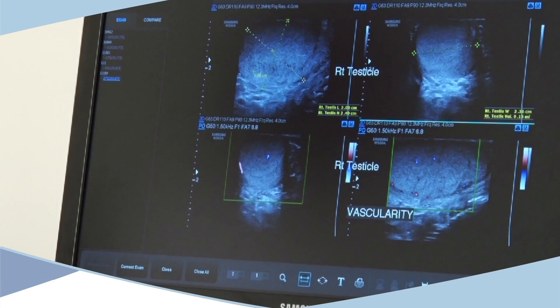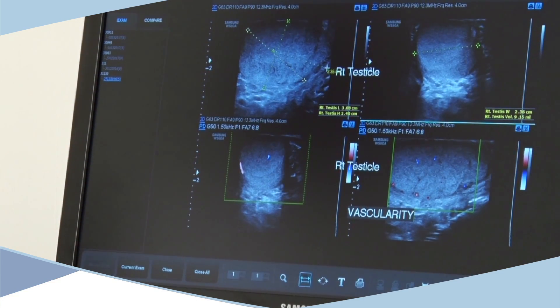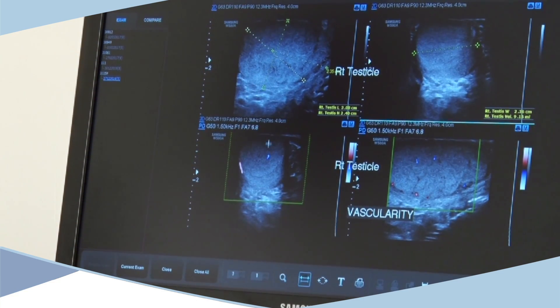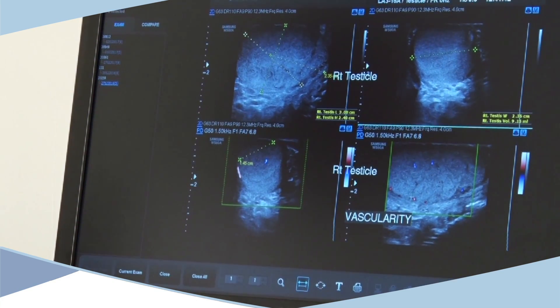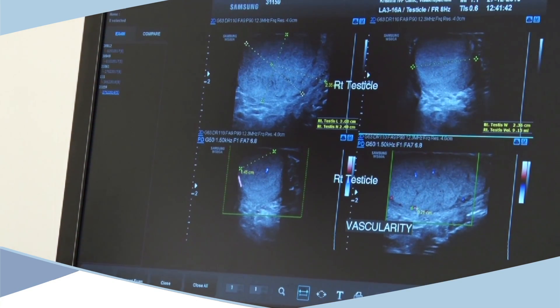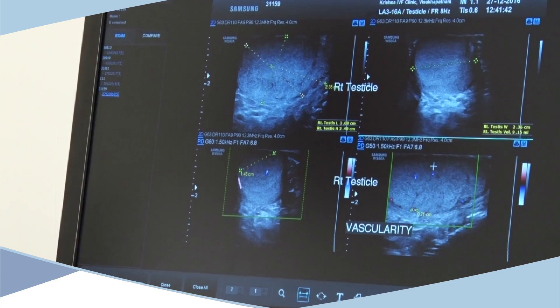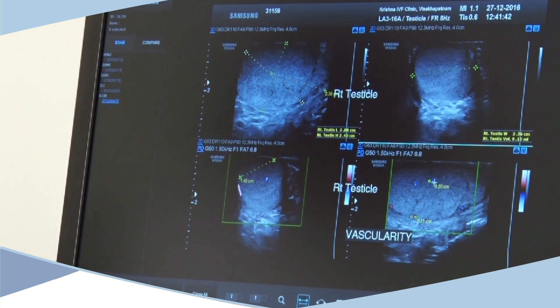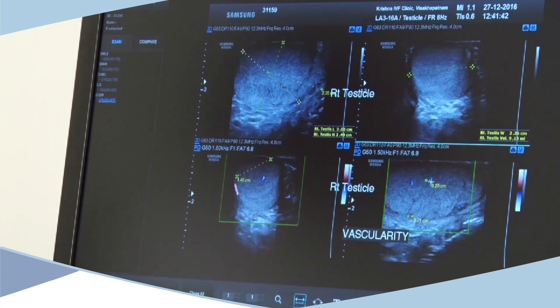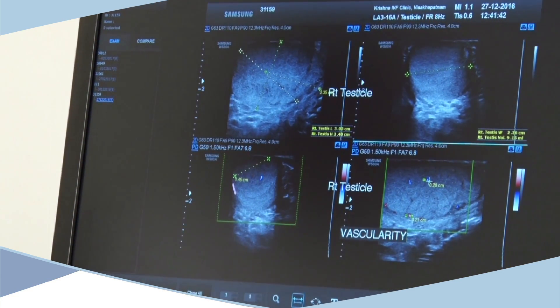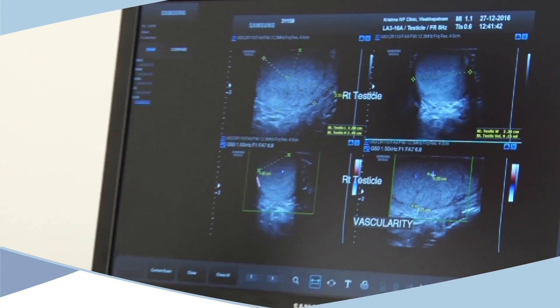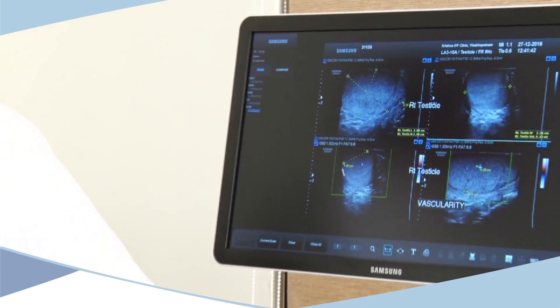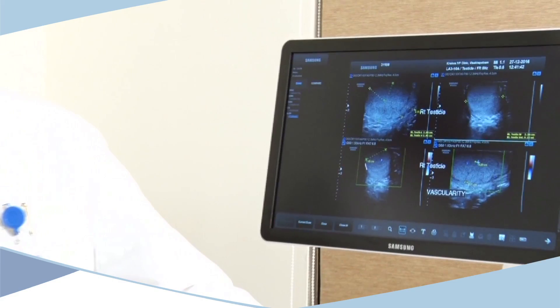Using this imaging, I can measure distances, look at circumference, and also measure the thickness of blood vessels to know how much blood flow is happening. This scrotal ultrasound also picks up certain early cancers which are sometimes present in the testis.